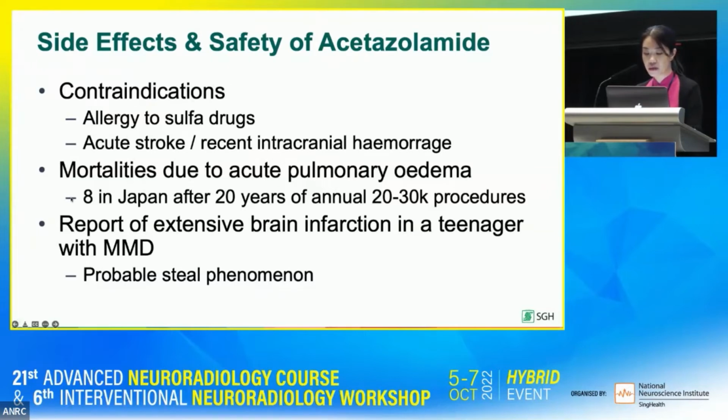This has been reported in 8 cases in Japan after 20 years of an annual caseload of 20 to 30,000 procedures. There was also a report of extensive brain infarction in a teenager with Moyamoya disease, probably due to a steal phenomenon when we administered the acetazolamide.